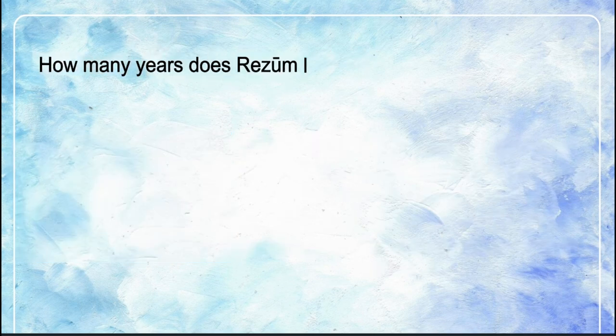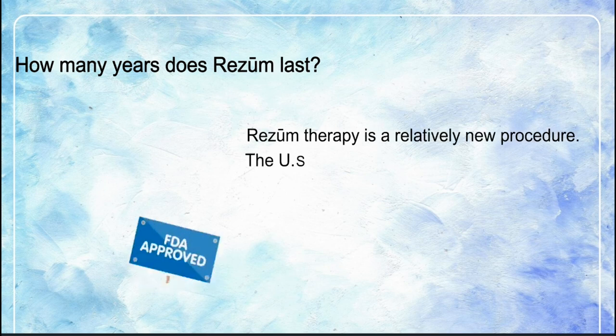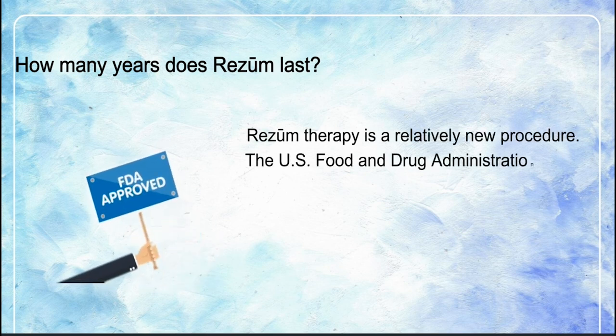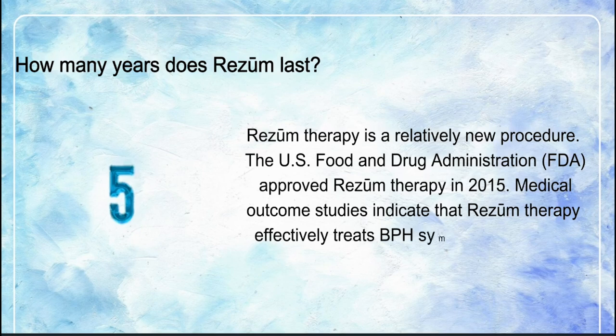How many years does Rezūm last? Rezūm therapy is a relatively new procedure. The U.S. Food and Drug Administration, FDA, approved Rezūm therapy in 2015. Medical outcome studies indicate that Rezūm therapy effectively treats BPH symptoms for at least 5 years.